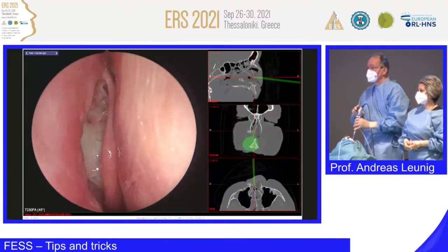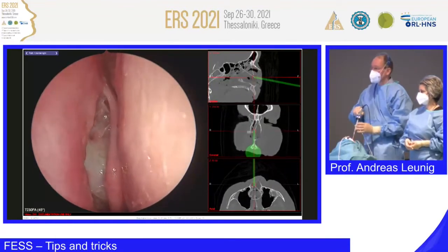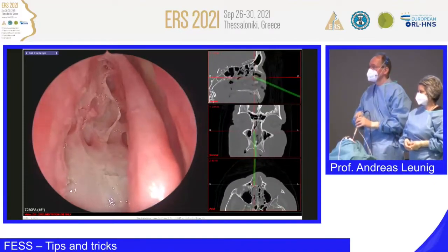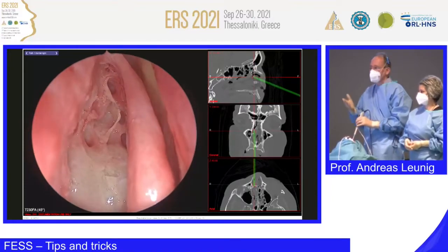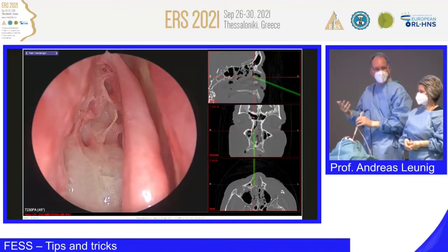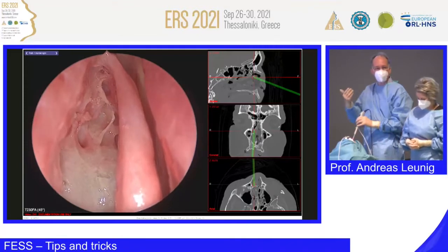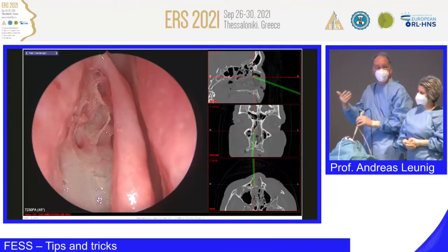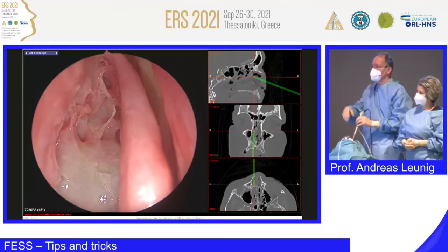I go in, very gently, the same situation. Please keep your endoscope in the same position. It helps a lot. I go in, and now I have a very nice view up into the frontal recess. What would be the reason to go further up into the frontal sinus if there would be any pathology? But the openings and clefts are looking not bad, but we will look a little bit later.